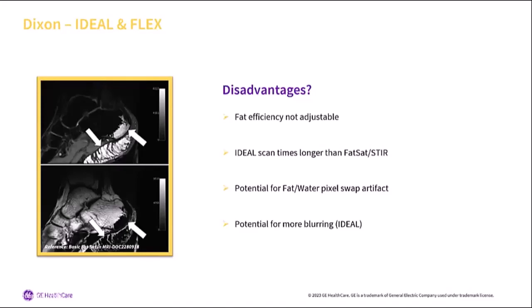And do not image in the presence of motion. So it is more likely to have a fat water swap if there's motion in our image.